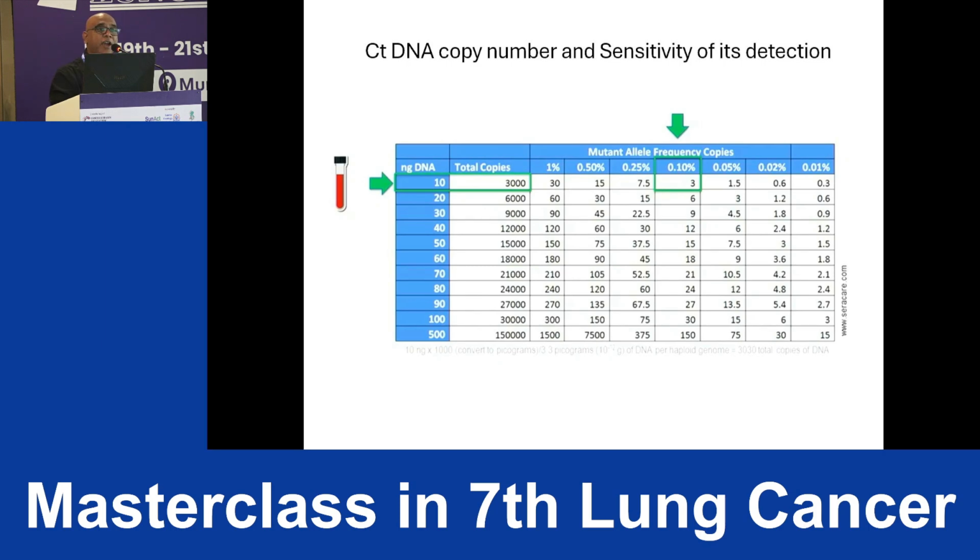Now, you would find a report coming back to your office in which they say that the variant allele fraction is 0.01%. You need to be very cautious of that. How can it be 0.01%? There are only 2 ways that it could be possible. Either you have taken 100 nanograms of ctDNA, that means you went for 100 ml of blood, which is not possible, or otherwise this would just not be deterministic at all.